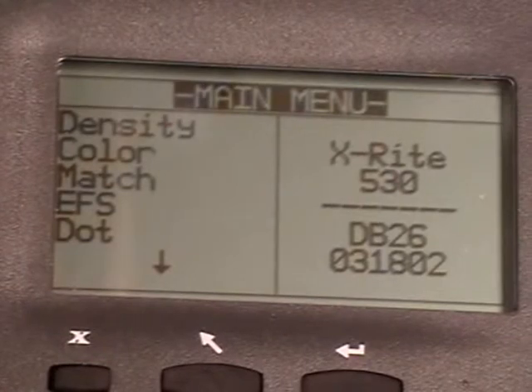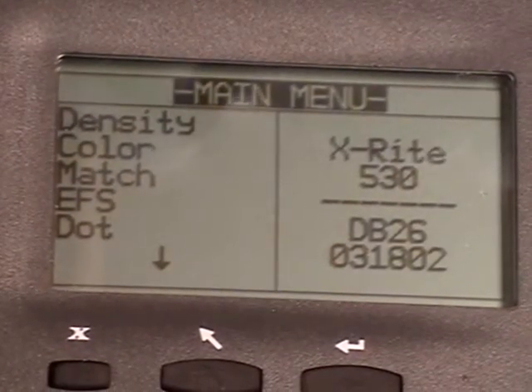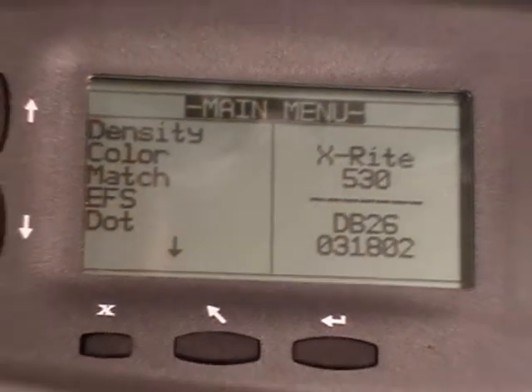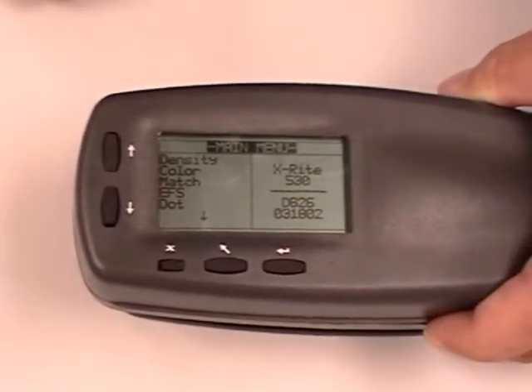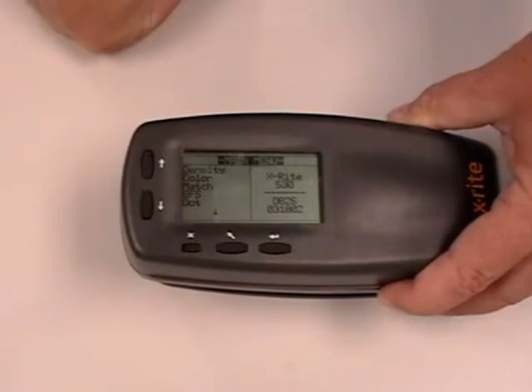This will do a reset. The screen is going to flash off for a second and come back on. Every time after any reset, you must do a full calibration. If after all three of these steps you are still getting an invalid measurement, then you need to call our support number, which will be at the end of this message. That is the invalid measurement for the 500.